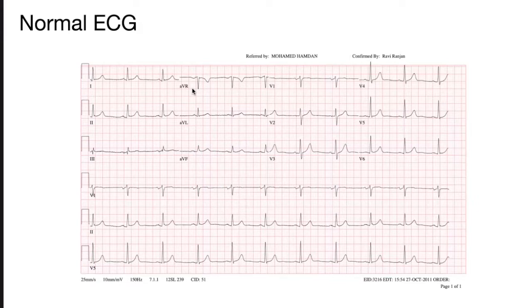How many electrodes do you guys think it takes to get all that information? Clinically, how many electrodes do they typically use clinically? It's 10. Okay, we got a guess for 10 then. 12. Any other guesses? Okay, Ben, why do you say 12? Well, because I've heard people talk about 12 lead ECG.